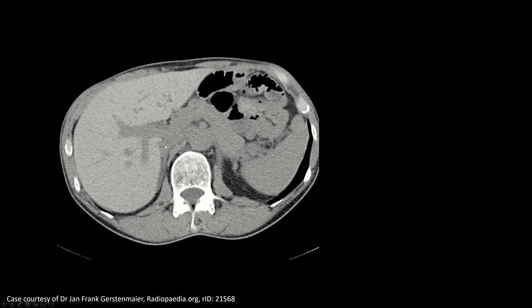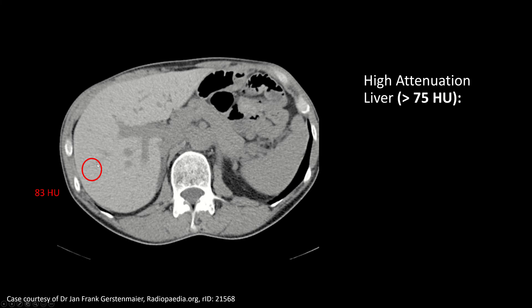Moving on — this is a non-contrast acquisition of the abdomen. We've drawn an ROI on the liver measuring 83 Hounsfield units. Remember, normal liver is most commonly between 55 and 65 HU, so this attenuation is pretty high. When background liver measures greater than 75 HU on non-contrast acquisition, that's considered abnormal. The most common causes are usually listed as hemochromatosis, hemosiderosis, Wilson's disease, glycogen storage disease, and medications like amiodarone and gold.